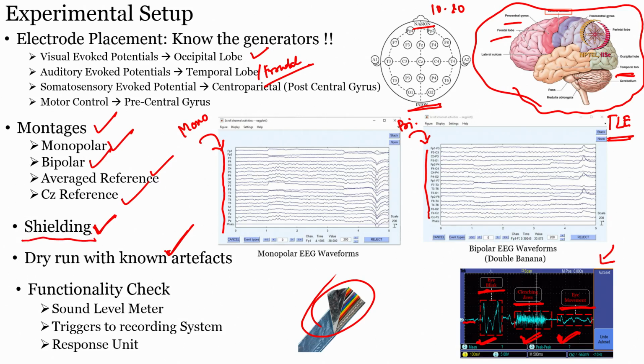It is a very small, known, classical point, but it still exists, and it is still one of the biggest bottlenecks when you are entering the field of neural signal acquisition. Once it is identified, that's completely fine, but you should always take care about shielding, trying to minimize all the artifacts, mostly power line artifacts.